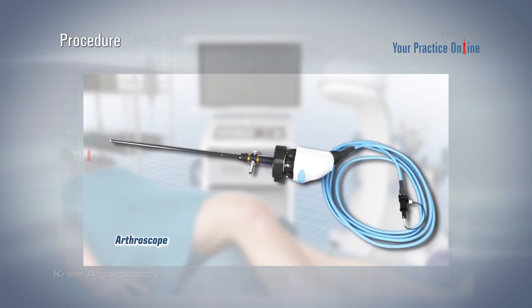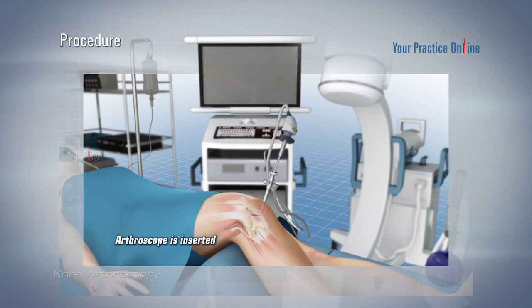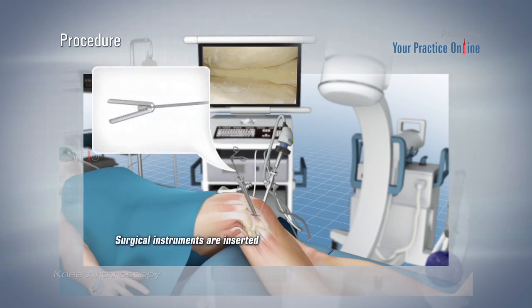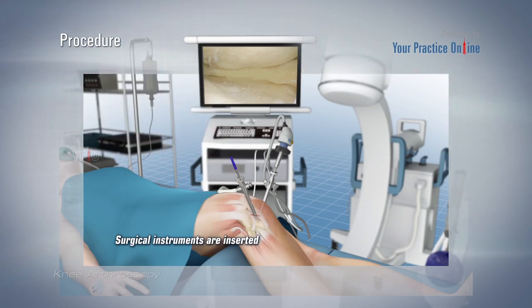An arthroscope, a narrow tube with a tiny video camera on the end, is inserted through one of the incisions to view the knee joint. The structures inside the knee are visible to the surgeon on a video monitor in the operating room. The surgeon first examines the structures inside the knee joint to assess the cause of the problem. Once a diagnosis is made, surgical instruments such as scissors, motorized shavers, or lasers are inserted through another small incision, and the repair is performed based on the diagnosis.